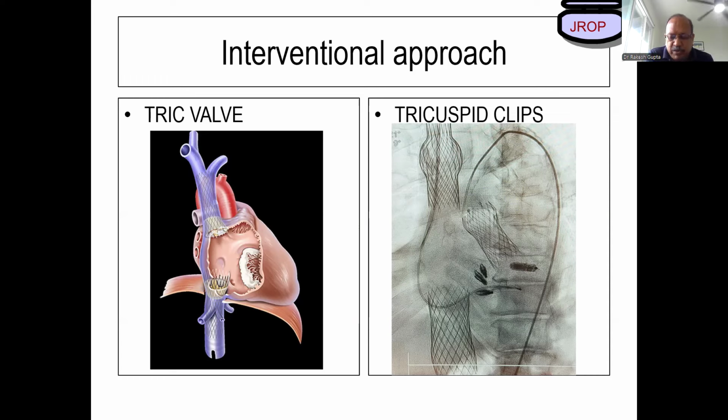Look, for whatever you said, how do I interpret that? That patient has got a dominant RCA with the posterior descending artery arising from RCA. That's why he or she has got involvement of the posterior inferior wall. And the feature of RV infarction is not dilatation. The feature of infarction is poor RV systolic contraction, which is seen by TAPSE, RV free wall TDI, or RV two-dimension strain. And as you said, IVC was dilated. I'm pretty sure that patient has got RV infarction.